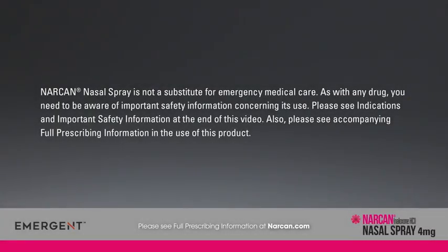Narcan nasal spray is not a substitute for emergency medical care. As with any drug, you need to be aware of important safety information concerning its use. Please see indications and important safety information at the end of this video, and please see the accompanying full prescribing information in the use of this product.